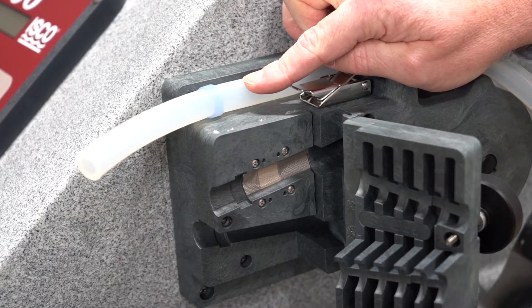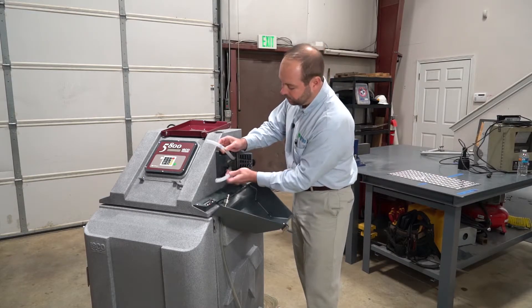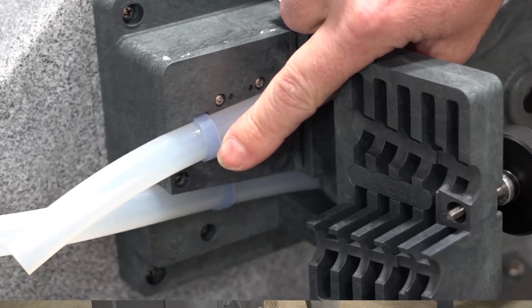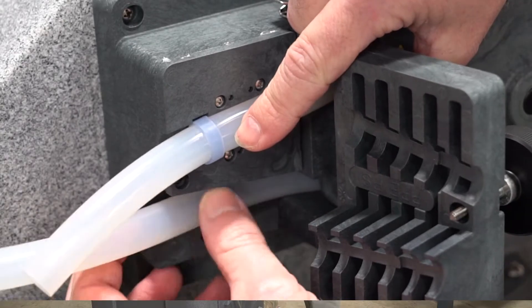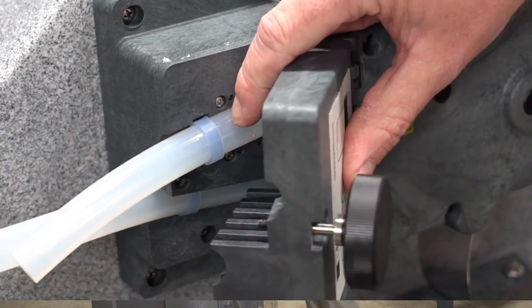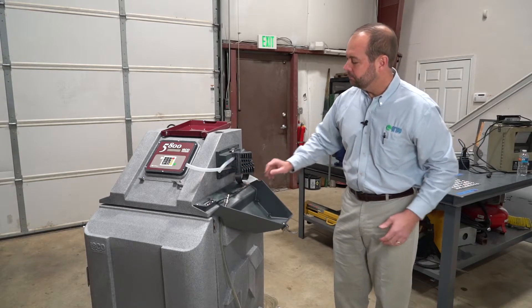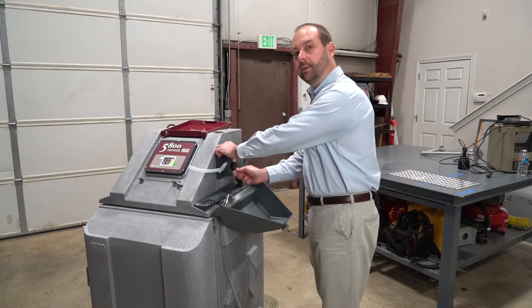You will notice on the pump tube we have alignment collars that are light blue in color. Those should be oriented into the cutouts — the alignment cutouts in the pump housing. Once the pump tube is properly oriented, close the liquid detector cover and secure with the black knob.